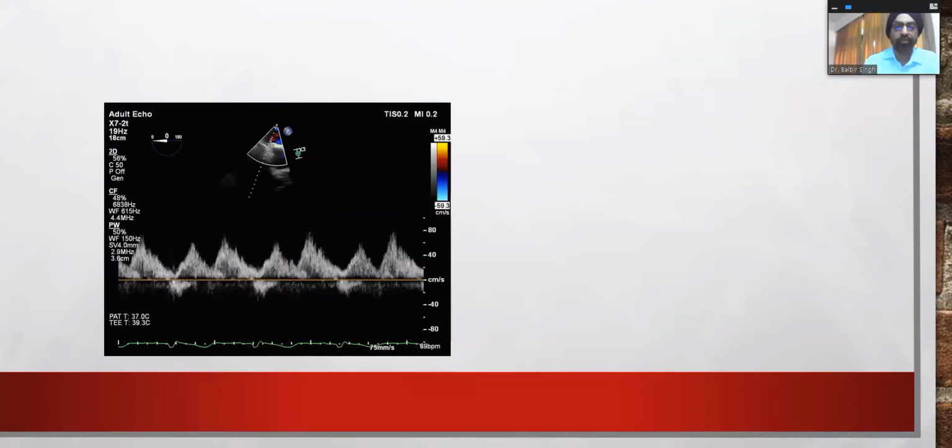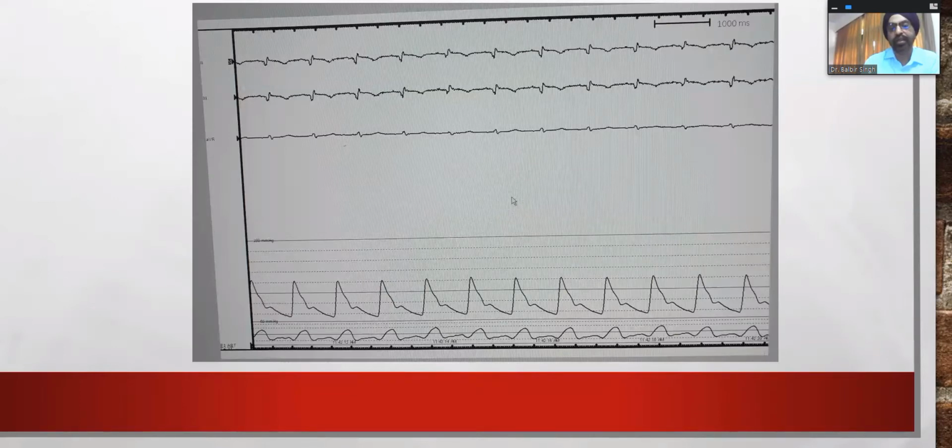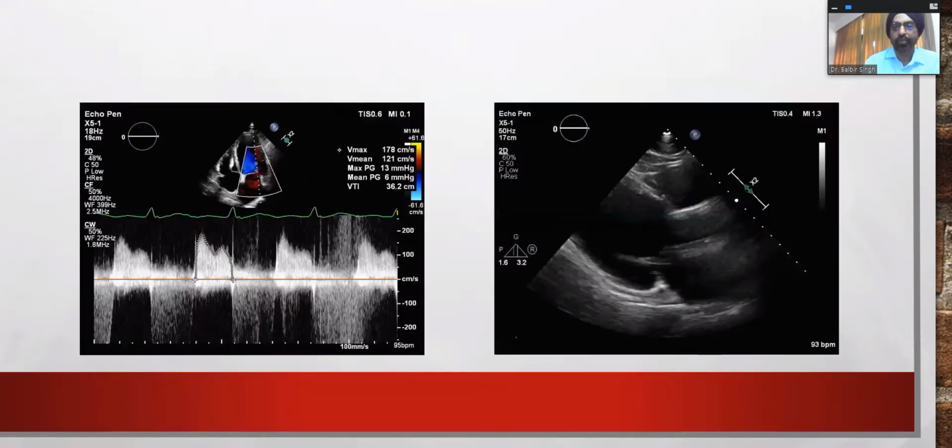This is the pulmonary vein, which was reversed, is showing a normal pulmonary vein flow. And you see the LA pressure fall down immediately while we clipped. It was above the aortic pressure, we saw that. And it was now 23. From 77, it was 23, which was quite a relief. We left some MR at that point in time, which I showed you.